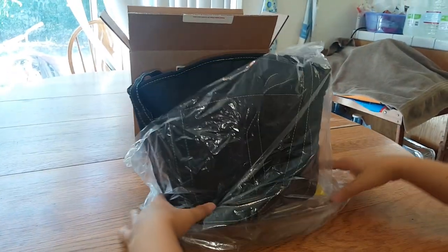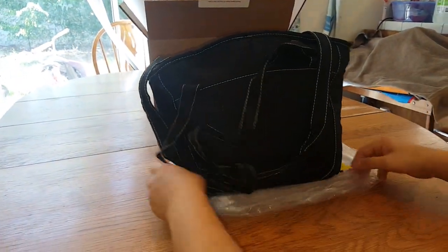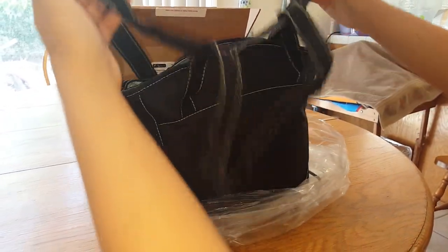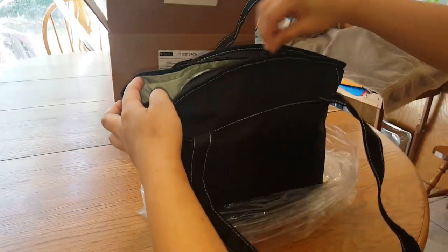So it comes in a bag just like this. Here's our black tote — cute. It's small, so very handy for traveling.